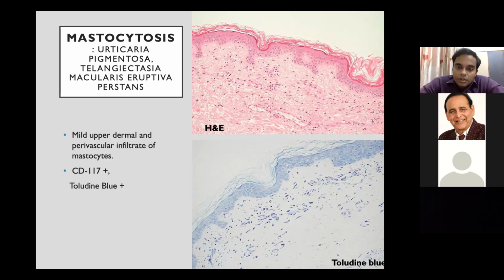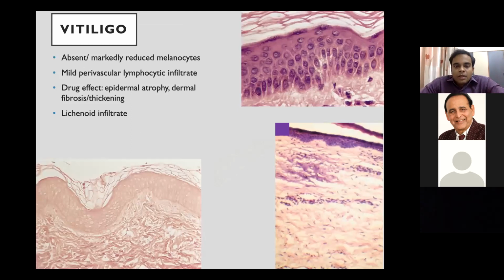Then you are more sure that it is urticaria pigmentosa. Okay, I have to think in that direction. Then special stains, of course, can confirm because they are very specific to mast cells. And then we move on from pigmentary disorders to hypomelanizing disorders.